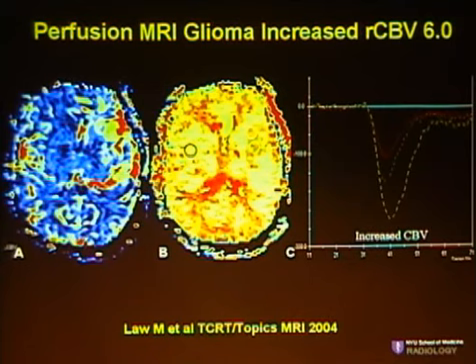So Dr. Kelly called me and said, look, we're getting calls from Mount Sinai not to operate on this patient. Are you absolutely sure that you're dealing with a tumor? So are we absolutely sure we're dealing with a tumor now that you've seen the MRS and the perfusion? Yes? Yes, right? So I said, Dr. Kelly, I'm absolutely sure we're dealing with a tumor. In fact, I'm so sure we're dealing with a tumor, I'm going to bet my house on it. And I could do that at the time because I didn't have a house. So I said, go ahead.